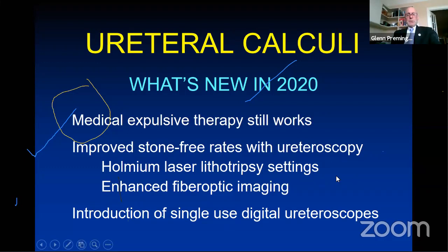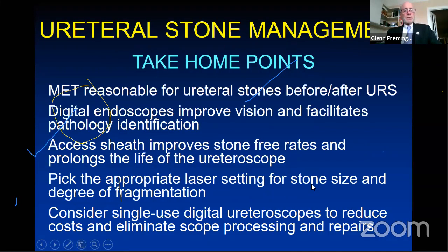So thank you. What are my take-home points? Medical expulsive therapy is reasonable for ureteral stones before and after treatment. Digital ureteroscopy improves visualization and facilitates pathology identification. The access sheath improves stone-free rates and prolongs the life of the ureteroscope.